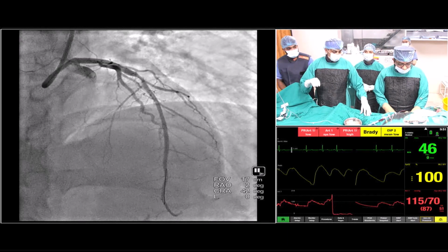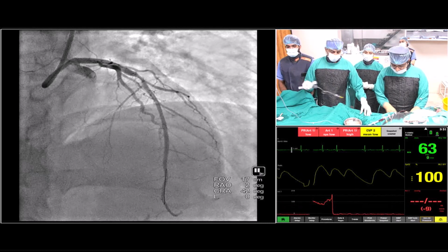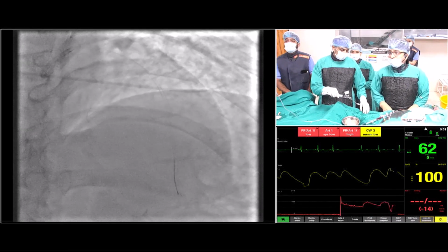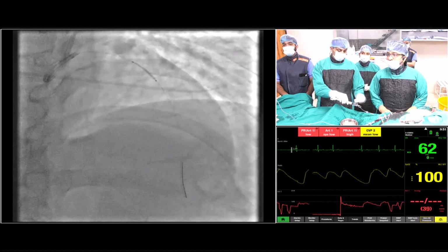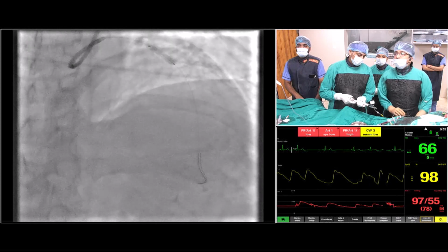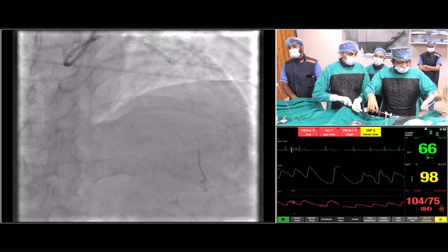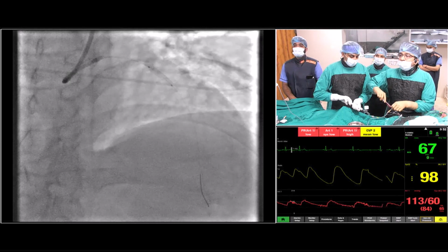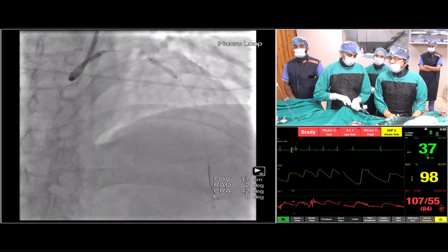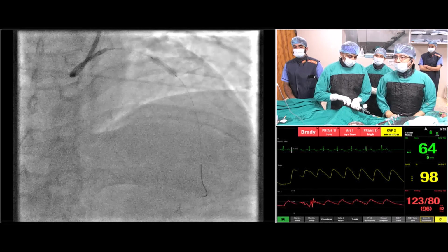We have taken a Medtronic Onyx 3 into 15 stent, and after deployment we intend to post-dilate with a 3.5 into 8 balloon. So just positioning my stent. So we've deployed the stent. Nominal is 12, so it's fine. Just a minute. Fluorosave, 15 seconds, 20 seconds, down.